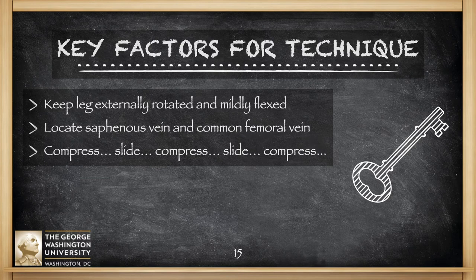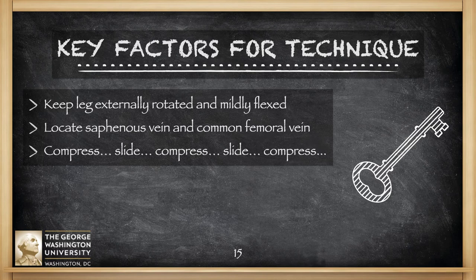Make sure that the patient has their leg externally rotated if they can tolerate that, and if they flex a little bit at the hip, it will make it a little bit easier to access these blood vessels. The sapheno-femoral junction is an absolutely essential portion of this exam. Some recent research discusses the possibility of doing just two-point compression versus three-point compression, but we recommend that you go down about a probe's width for each level of compression, doing graded compression down the entire blood vessel until you essentially lose it behind the femur.